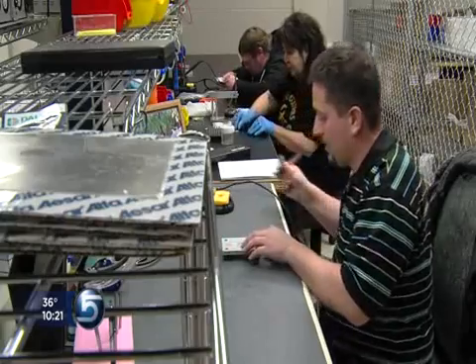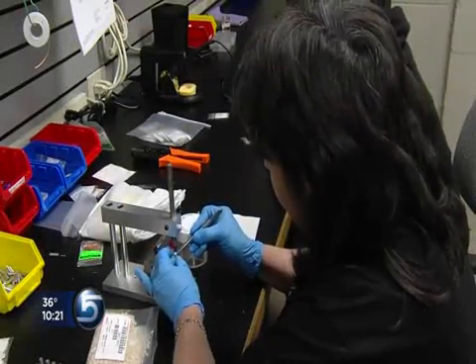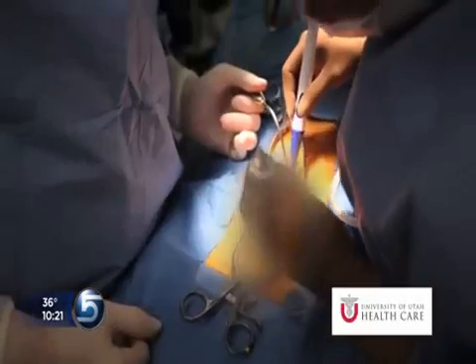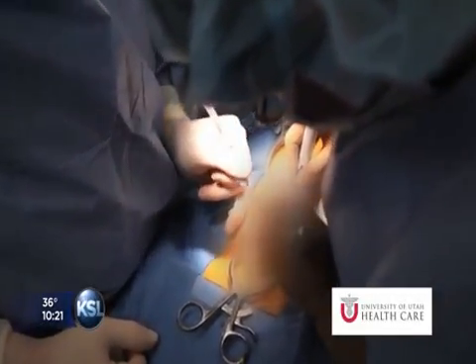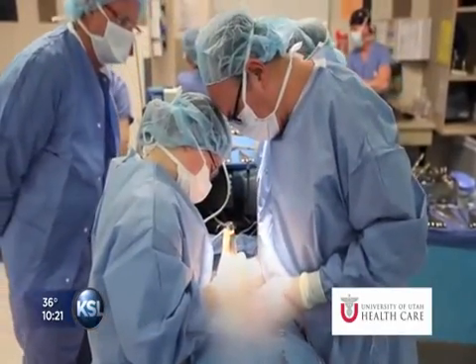From a garage to a basement to what is now Domain Surgical, the wand has its roots here in Utah. Now with FDA approval, it's being used on the first human patient. What Dr. Manwaring envisioned has become a reality. The ideal combination is an incision that is a pure searing or sealing of the margin with no bleeding, and yet right beneath that sear is perfectly viable healthy tissue.